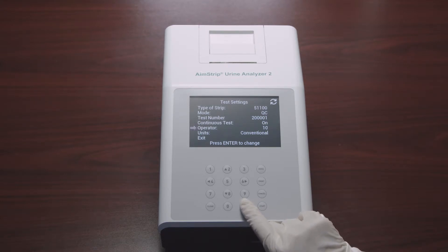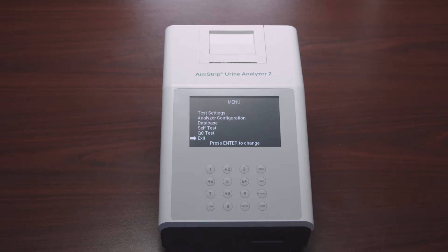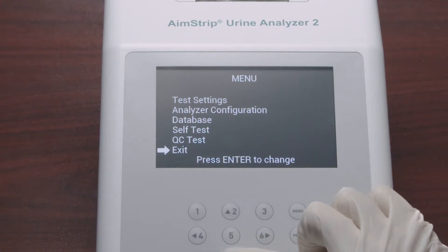The last option in the test settings is Units. Select Units and press Enter to cycle between conventional or SI units. Once you finish all your selections for the test settings, select Exit and press Enter to return to the main menu.